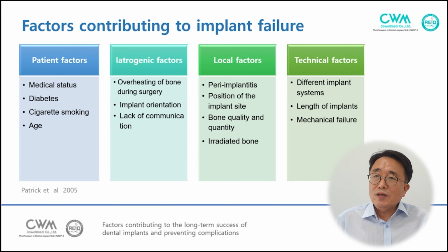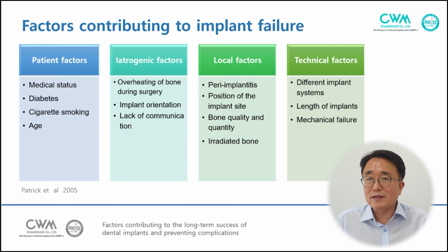Factors contributing to implant failure: first, the patient factor, second, the iatrogenic factor, third, the local factor, and fourth, the technical factor. Patient factor is composed of medical status, diabetes, cigarette smoking, and age. Iatrogenic factor is overheating of bone during surgery, and second, implant orientation and lack of communication.